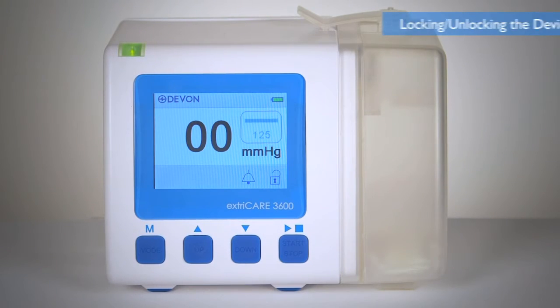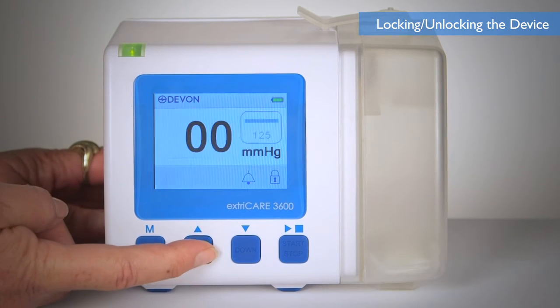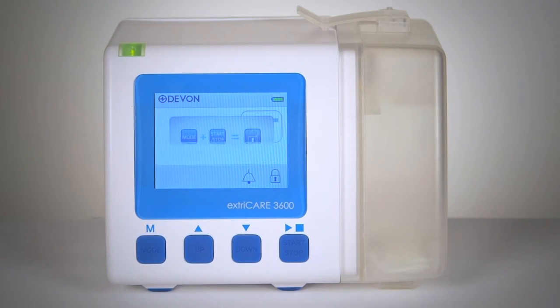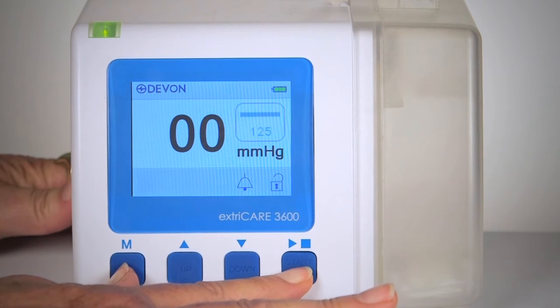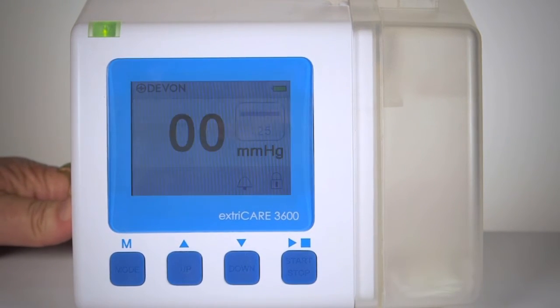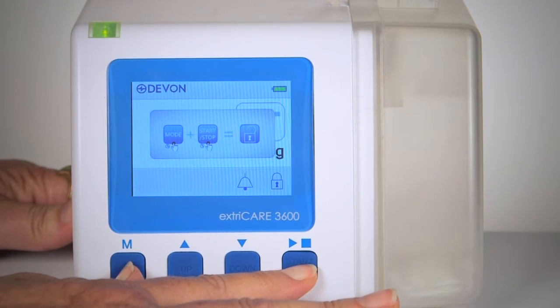The ExtraCare 3600 pump will automatically lock if the device is inactive for 3 minutes. If this occurs, pressing the buttons will illuminate the screen but the settings will not change. To manually lock the device, press and hold the mode and start and stop buttons for 2 seconds. To unlock the device, press and hold the mode and start and stop buttons for 2 seconds.